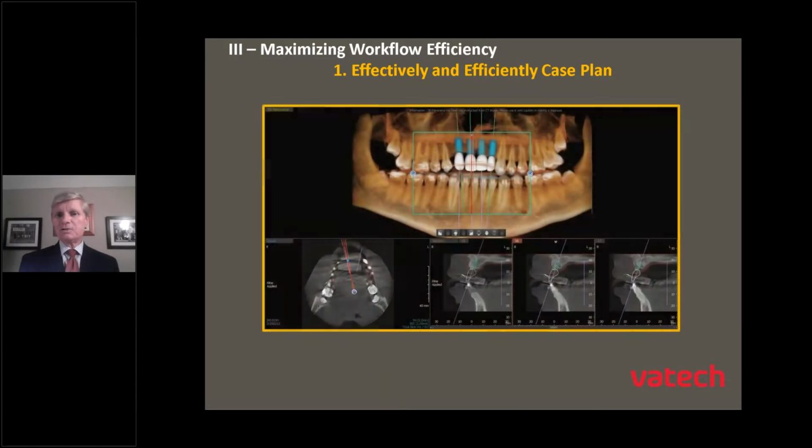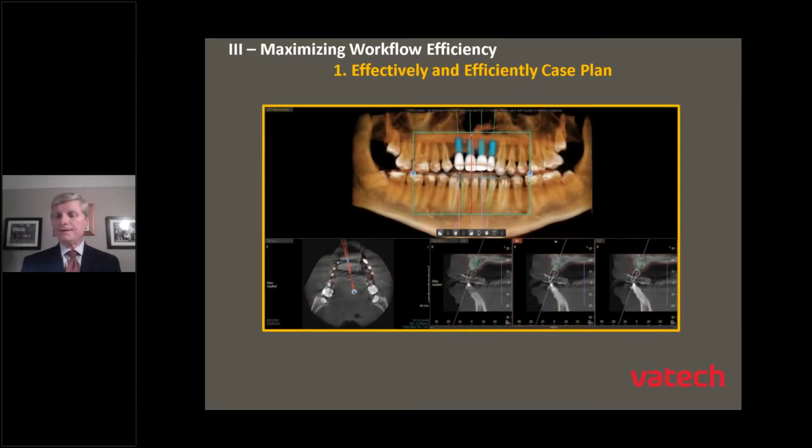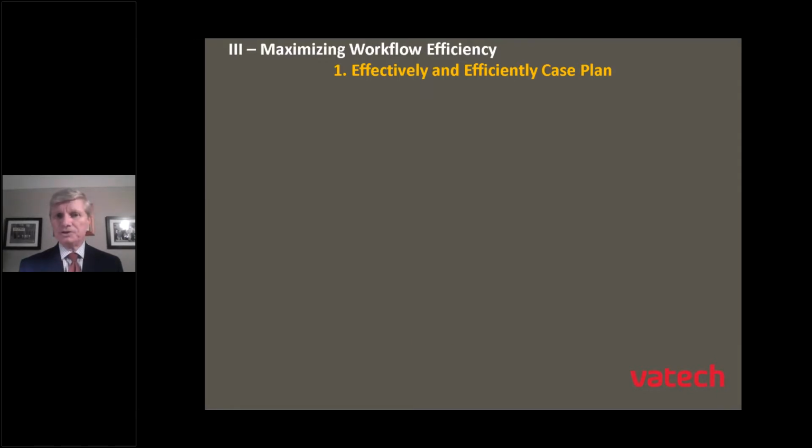So taking it one step further, okay? So let's say I've gone through, I'm in my private office, okay? I placed 4 virtual implants in the anterior region of this patient's arch. The patient was a trauma patient here. And what I want to do next is this.